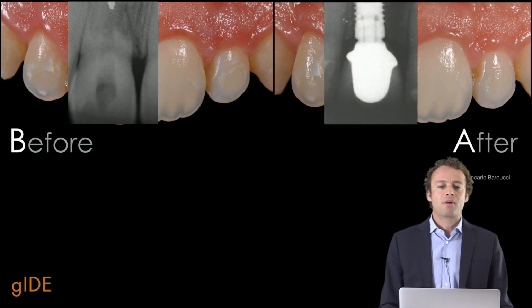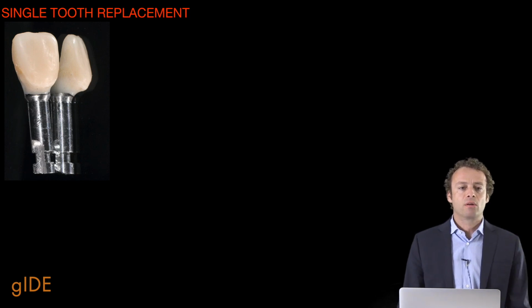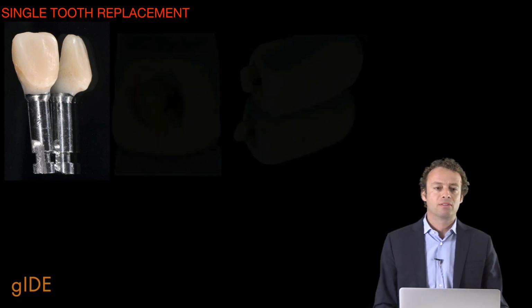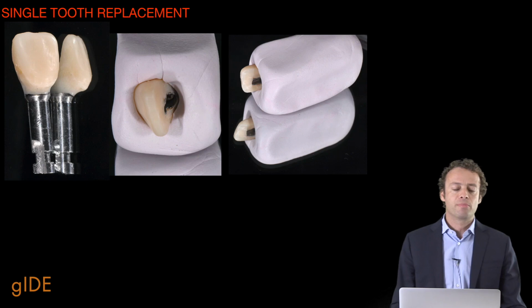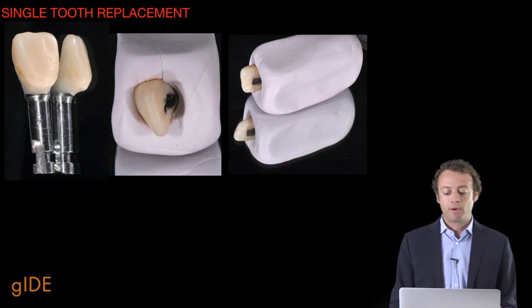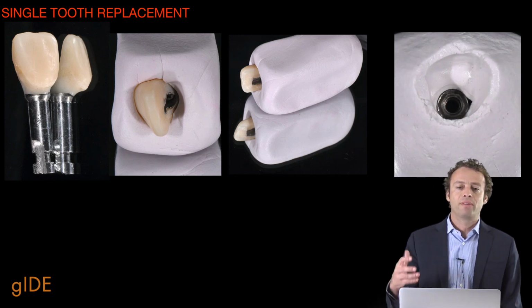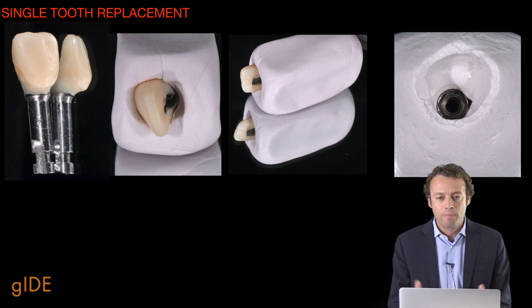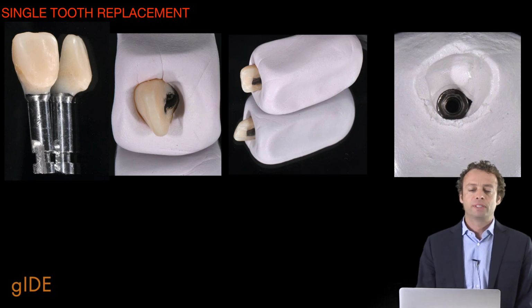So, just to summarize the technique, in this case where we have to manage just one single implant, we simply connect the temporary restoration to the implant replica, then use some silicone material, where it's important to be able to recreate the negative shape of the temporary. And here, exactly in these pictures, we can see how we have the implant replica embedded inside the silicone, and at the same time we have the negative shape of the subgingival portion of the temporary.